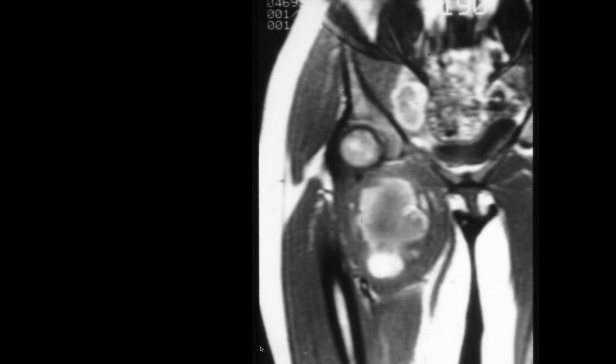I'm worried about, again, another synovial sarcoma. On the coronal images, it's heterogeneous and probably has some necrosis with the low signal. This is a T1 weighted image, so it's more proteinaceous. I guess it could be fat or it could be some blood products. Melanoma, I mean, less likely. Yeah, melanoma wouldn't be this bright. So I'd really be concerned about blood.